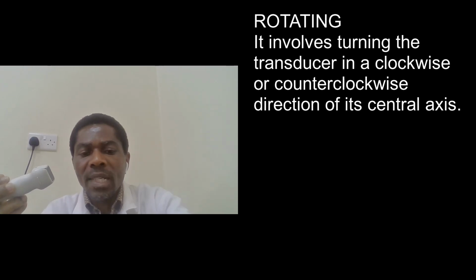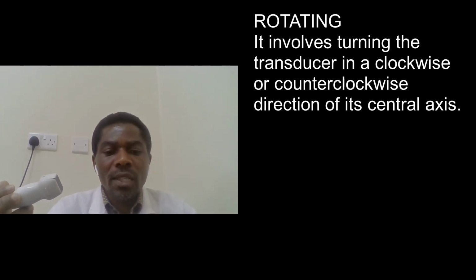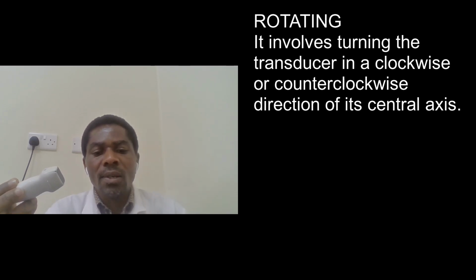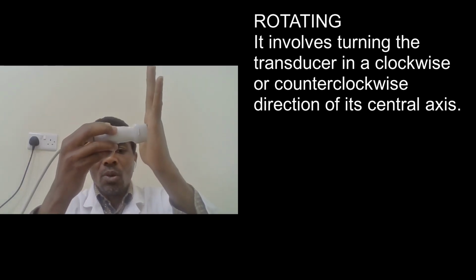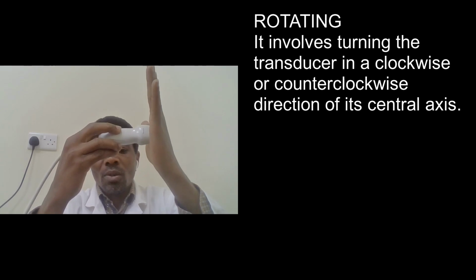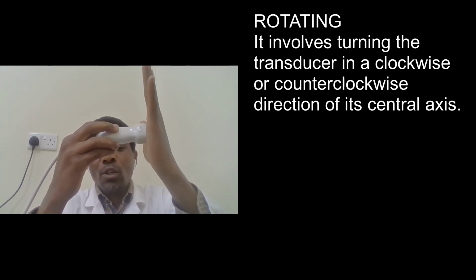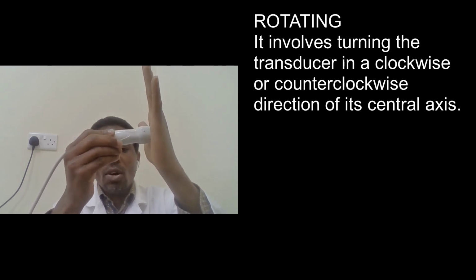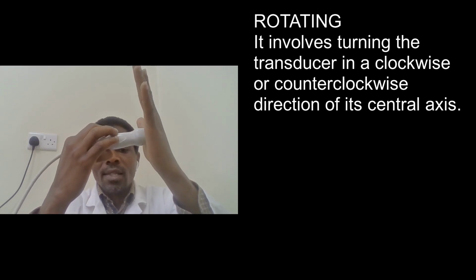The fourth movement is rotating. Rotating involves turning the transducer in a clockwise or anti-clockwise direction along its central axis. So rotation, we try to move the transducer in a clockwise or anti-clockwise direction.